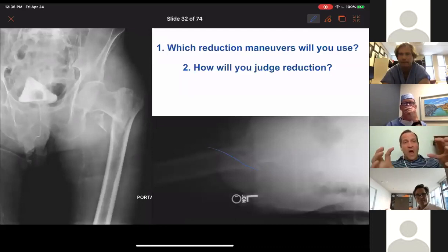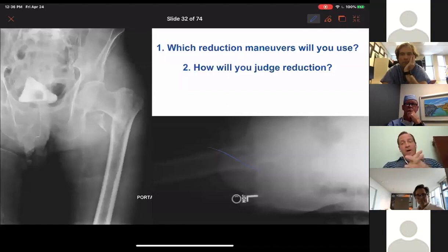100%. So to get to your question on sequence, I'll pull some traction and I'll try to jiggle the rotation just to unlock that oblique plane fracture line. And often these need kind of an A to P clamp, which I don't do too often. And so as far as sequence, that's about it. And then the sequence follows based on what it needs. So sometimes we'll get a hook over the calcar or a ball spike laterally or anteriorly.